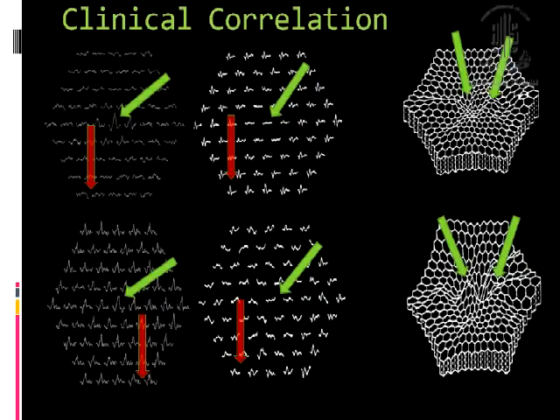This can be produced by many diseases, including RP, including even heavy laser can give you this picture. Someone who has PRP, heavy PRP, can give you this kind of picture.